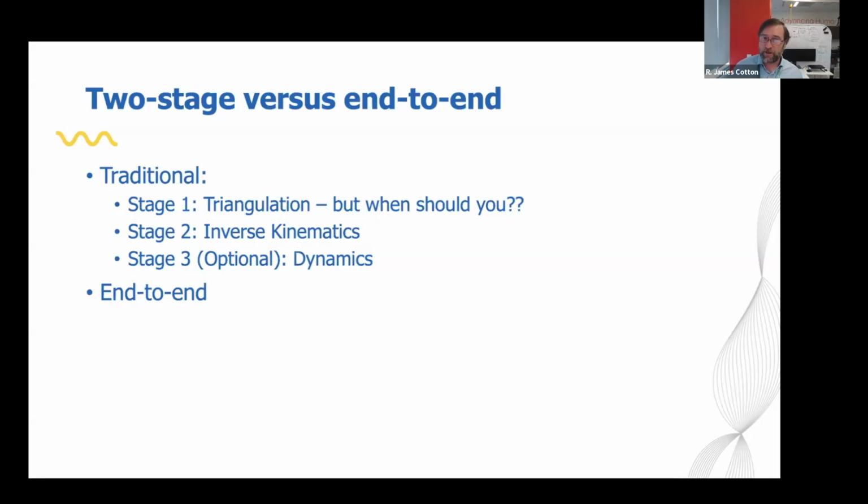It's not as sensible in the case of computer vision because there's a lot of noise in the detections from each camera. And what you really want to do is allow what you know about biomechanics to constrain that optimization. So if someone's limb length is something, that will really inform where their joints should be, or the combination of joints. And if you don't take that information into account when you're creating the trajectory and just naively triangulate, you're not going to do as well. And our papers have shown that.